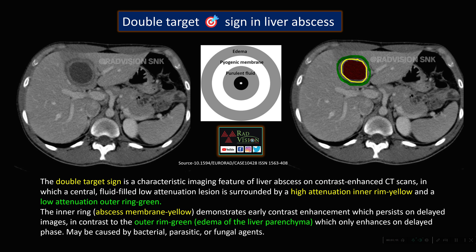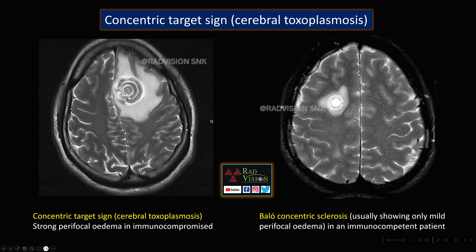The abscess membrane shows early contrast enhancement which persists on delayed images, in contrast to the outer rim — the edema depicted in green — which only enhances on delayed phases. This typical double target sign is seen in liver abscess and can be seen in bacterial, parasitic, or fungal infections.